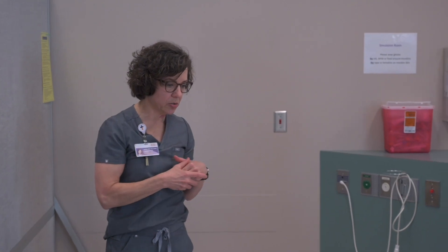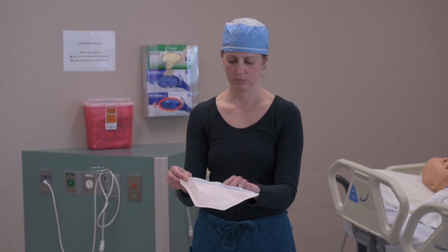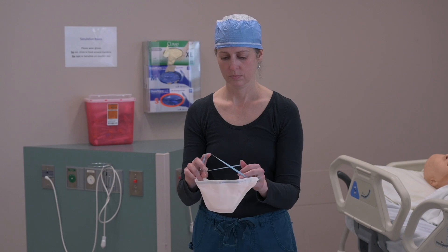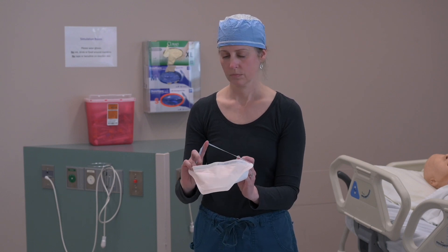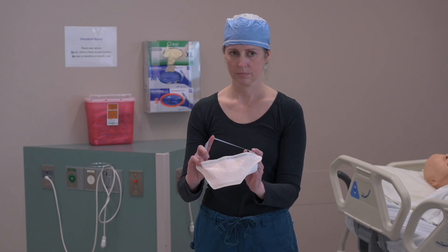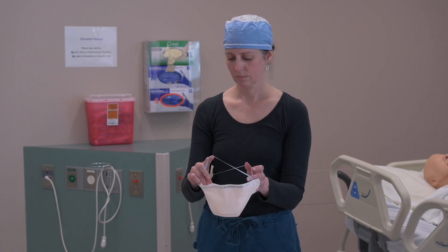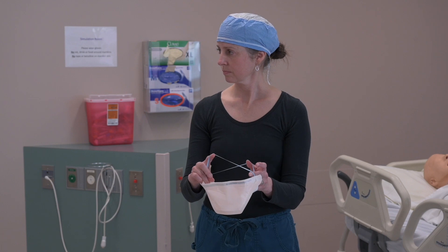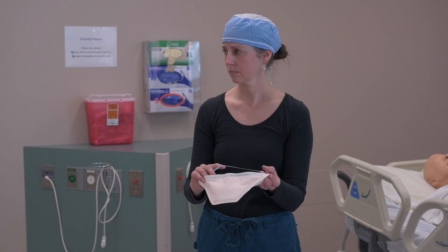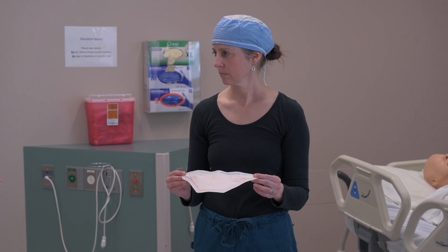This is an N95 respirator, which is the actual mask we're going to use in the donning and doffing demonstration. This provides a closer fit and also provides efficient filtration of aerosolization or droplets that could become aerosolized. We wear this mask in a COVID-19 patient room when there could be an aerosolized procedure in place — for example, if somebody's having a breathing tube put in or taken out.